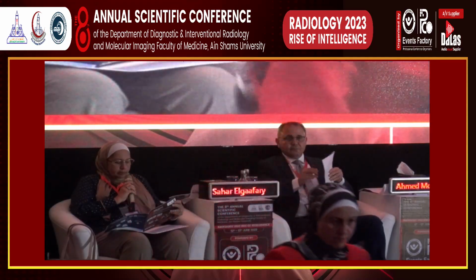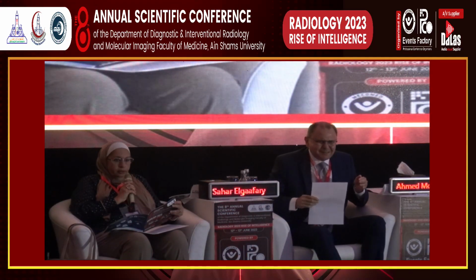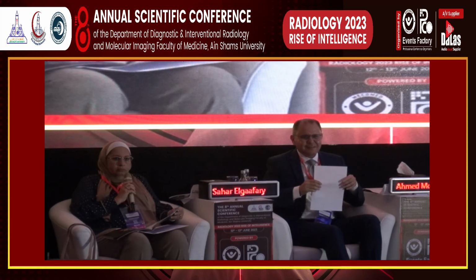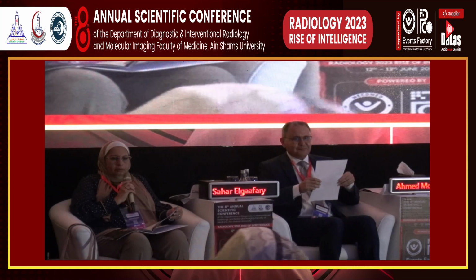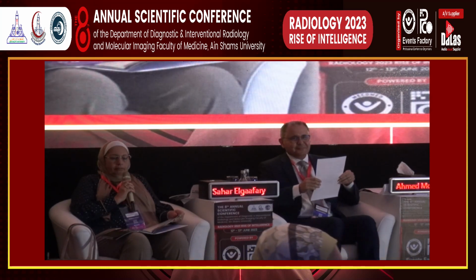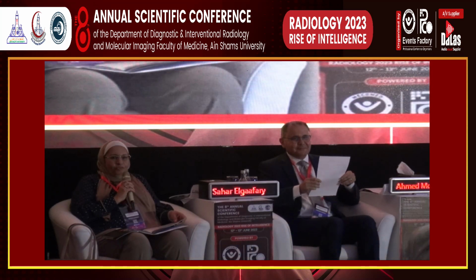Biparametric versus multiparametric MRI for prostate cancer.